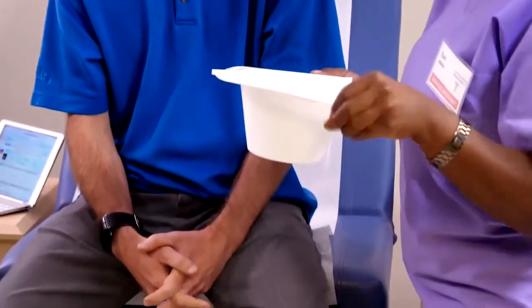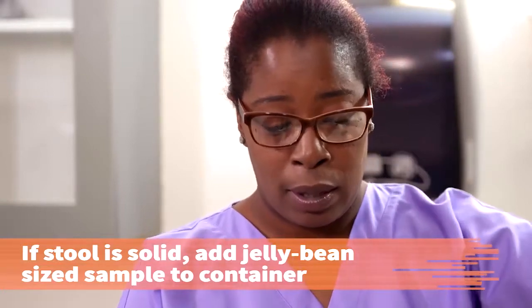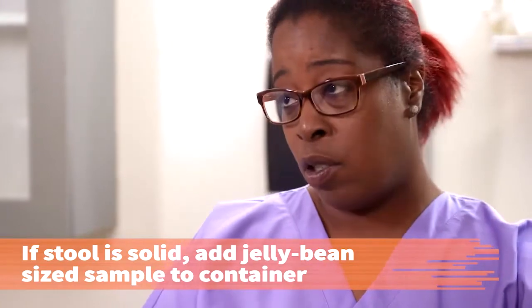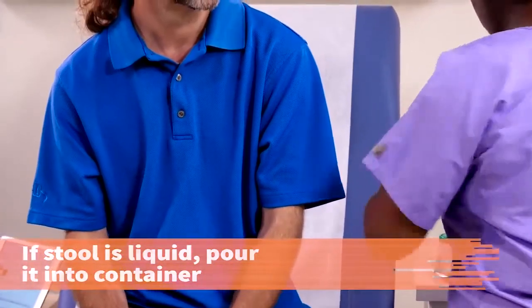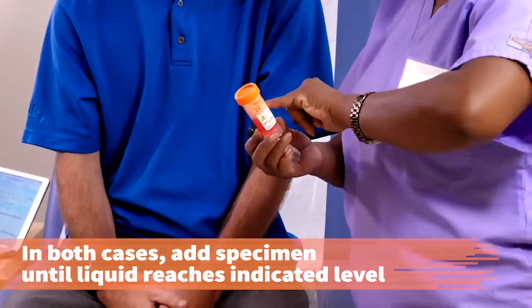Instruct the patient to add stool to the collection vial or vials. If the stool is solid, he should use the scoop on the lid of the container to add a large jelly bean-sized piece of stool to the liquid in the vial. And once you do that, you will have this container, and then I will also give you a spoon, or you can get your own spoon, to be able to get the sample out of the hat. If the stool is liquid, pour it into the container. In both cases, keep adding the specimen until the liquid preservative in the vial reaches the indicated level.